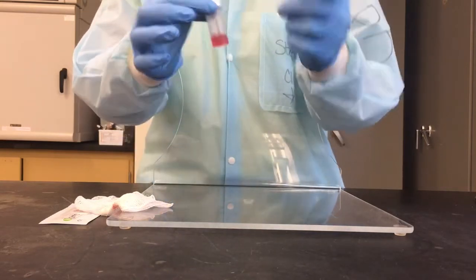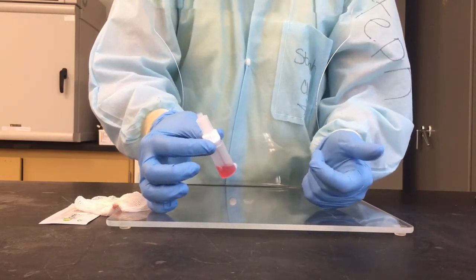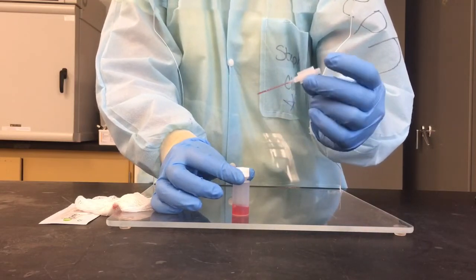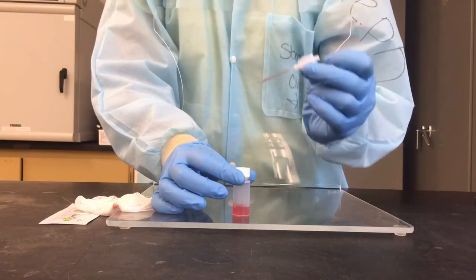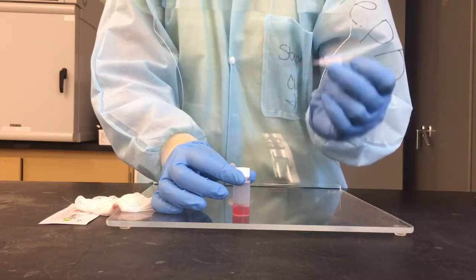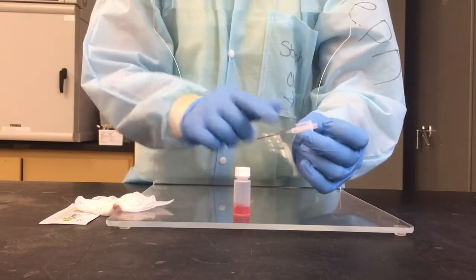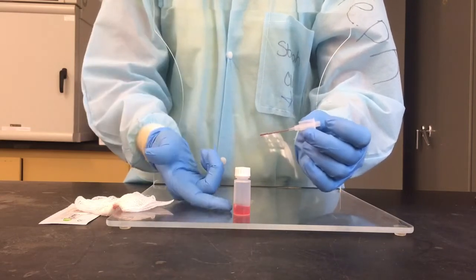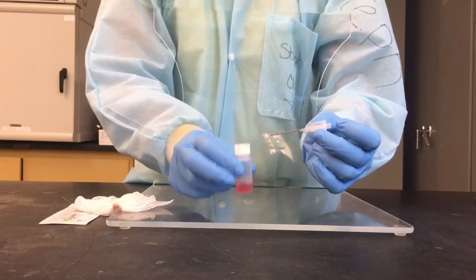If you look in here now, you should be able to see that the specimen is pretty much all inside my reservoir, and if I pull my capillary tube out, I've just got some residual stuff that's left in it. But I need to get this residual stuff out, right? I don't want to leave this in here, because then I'm also going to have an inaccurate specimen. If this is a higher blood concentration than this, and most of my specimen's in here and not in my reservoir, I'm going to end up with a falsely low count.